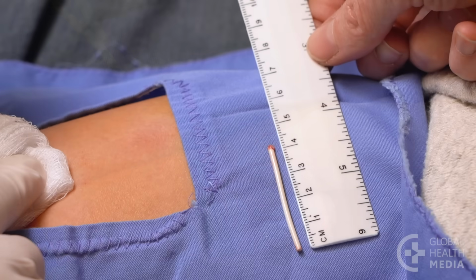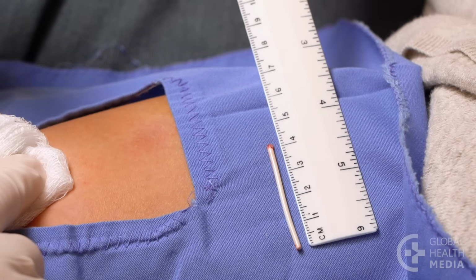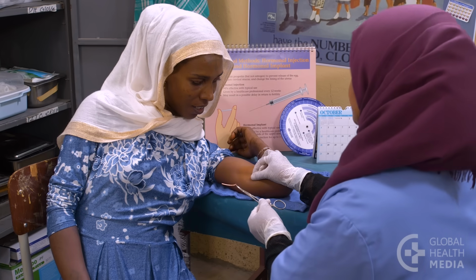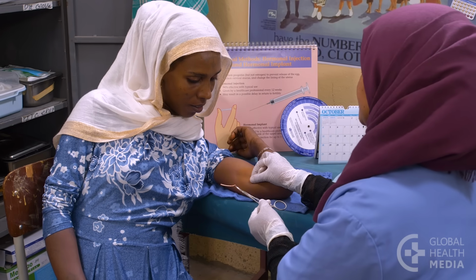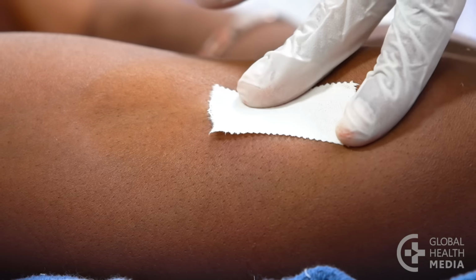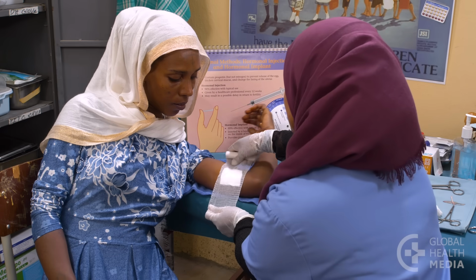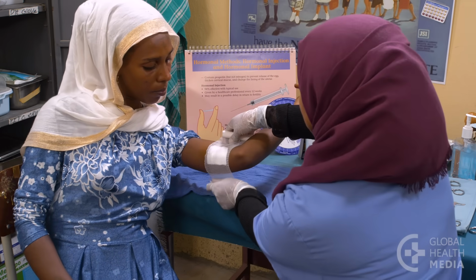For all approaches, measure the implant to be sure it is complete. Show it to the woman. Close the incision with an adhesive bandage. Apply a gauze square on top and secure it by wrapping a length of gauze roll snugly around the arm.